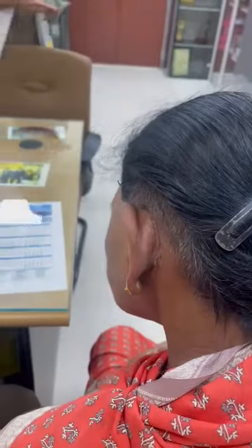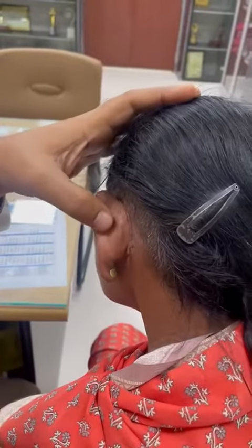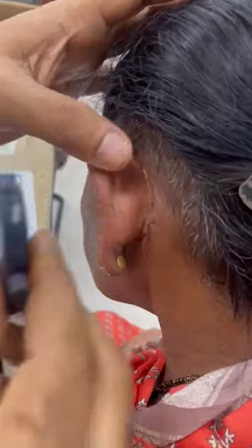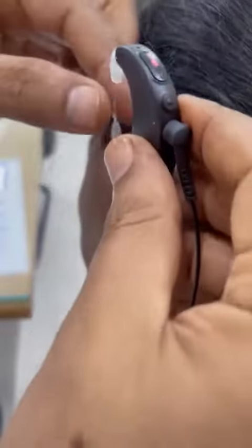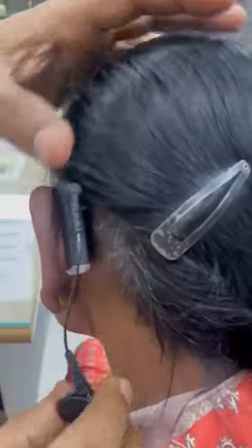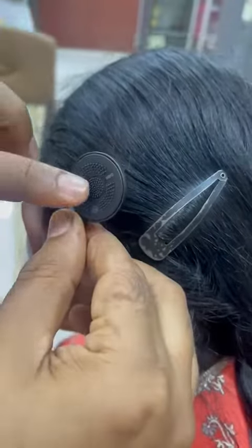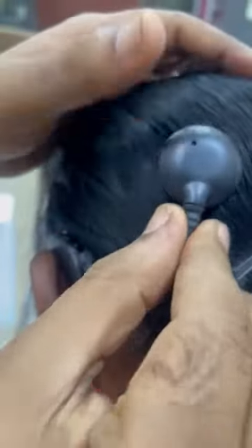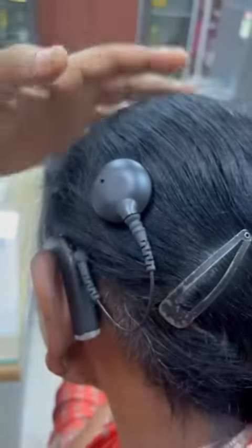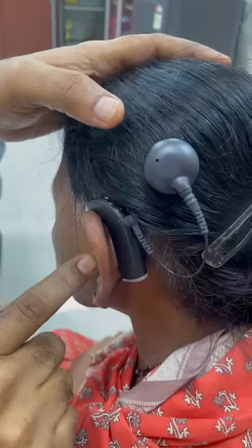So this is the implant. This is the outer part. The internal part we have implanted through this operation. And this is the outer part I am fixing on the ear. This will stick with the help of this magnet here — it will catch automatically. The internal part is also having a magnet, and the external part is having a magnet.